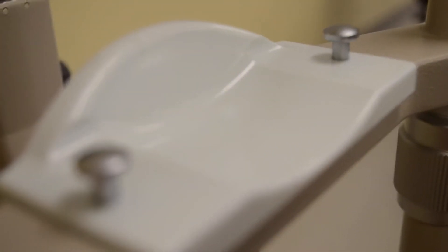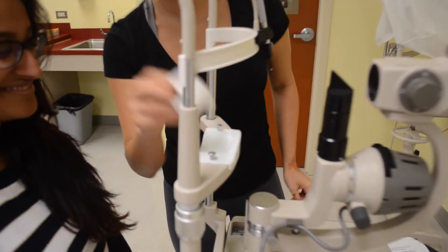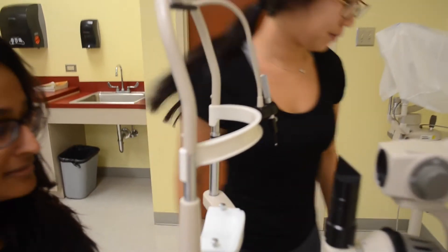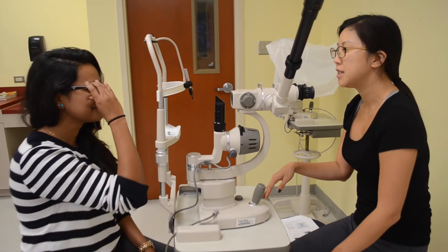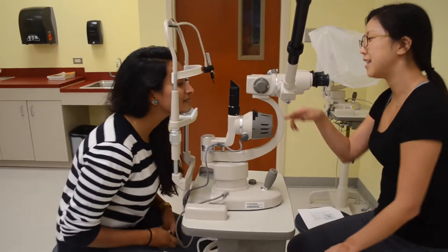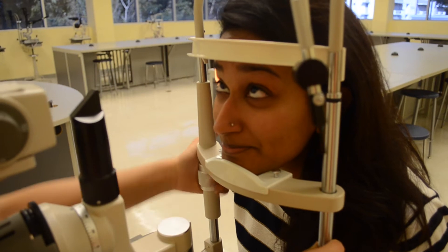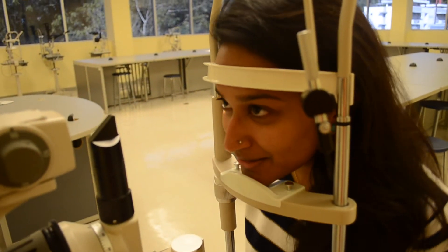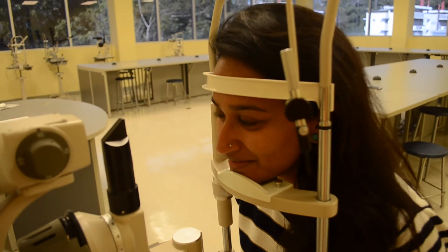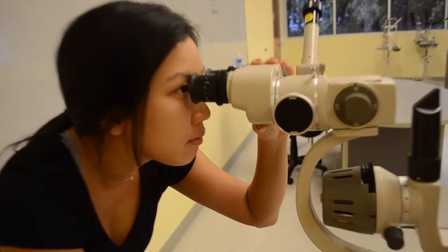Do you mind putting your chin and forehead against the machine, please, and take off your glasses. Just like that. Okay, ready. Push your chin and forehead against the machine. Okay, take off the glasses. Okay.